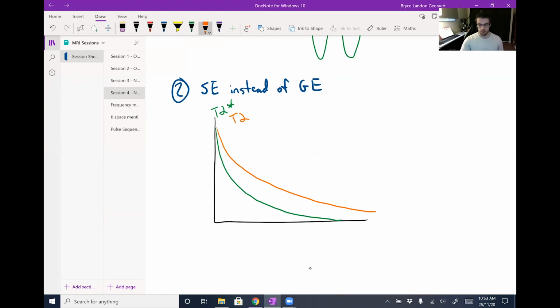Can you explain why noise is static no matter the voxel size? For example, if there's noise because of imperfections in the B0 field, then there are more imperfections in the larger voxel, right?